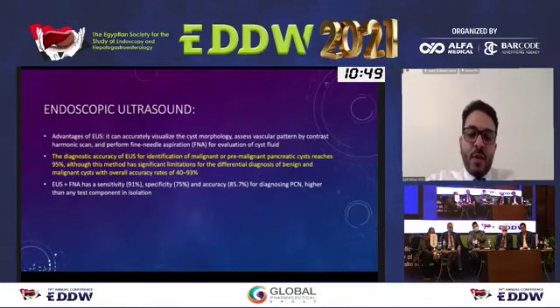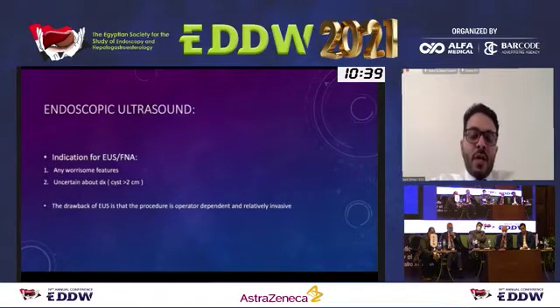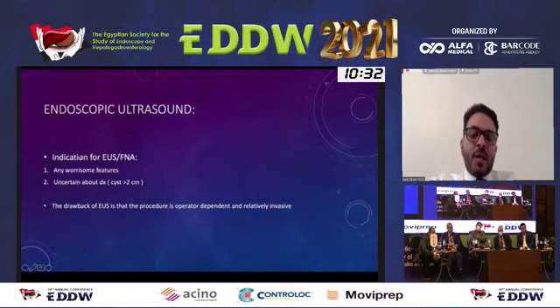EUS FNA has a sensitivity of 91%, specificity of 75%, and accuracy of 85% for diagnosing pancreatic cystic neoplasm. Now, you don't have to do endoscopic ultrasound for every pancreatic cyst, and these are the indications to do endoscopic ultrasound evaluation for a pancreatic cyst.